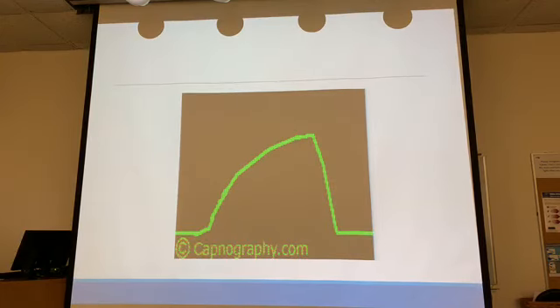What's this? Shark fin. What does that mean? Bronchospasm. Asthma, yeah, bronchospasm, right? So you're going to treat that, and you're going to see it as they're opening up. You'll see it go back to a rectangular waveform.